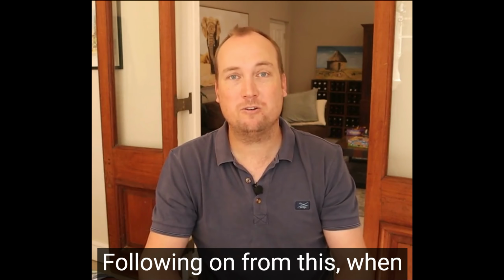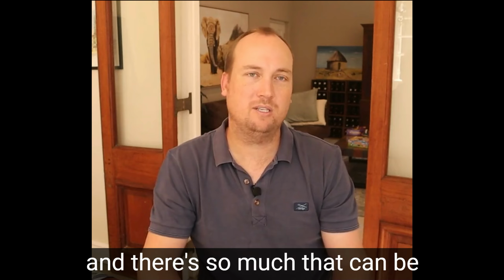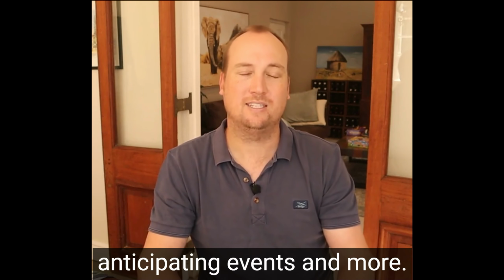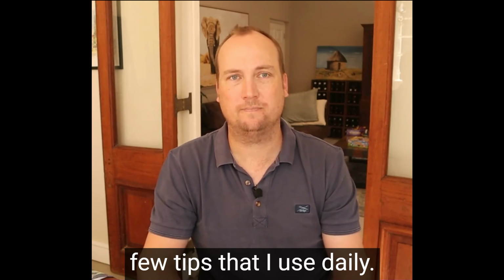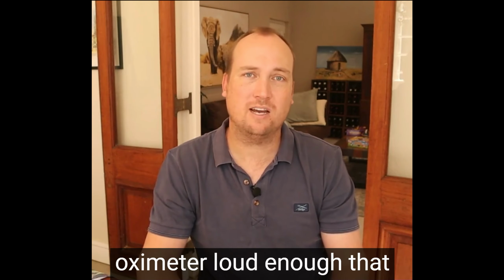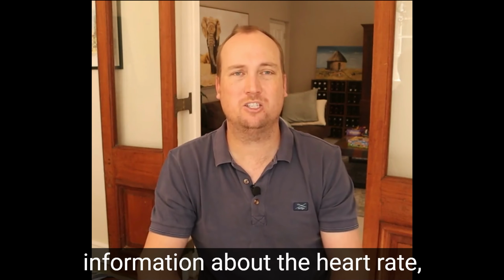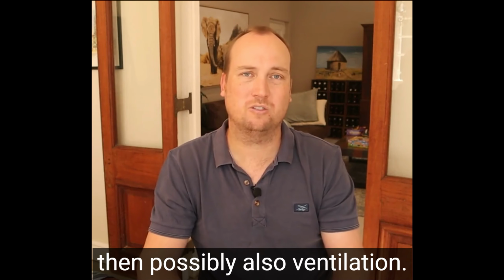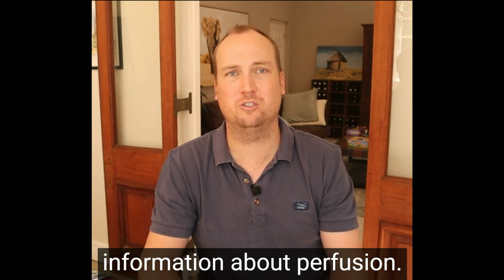Following on from this, when you're in theatre, pay attention. There's so much that can be said here regarding watching the monitors, watching the surgery, anticipating events, and more. I'll just give you a few tips that I use daily. I want the volume of my pulse oximeter loud enough that everyone in theatre can hear it. The pulse oximeter gives us information about the heart rate, the rhythm, oxygenation, and then possibly also ventilation. It also gives us indirect information about perfusion.